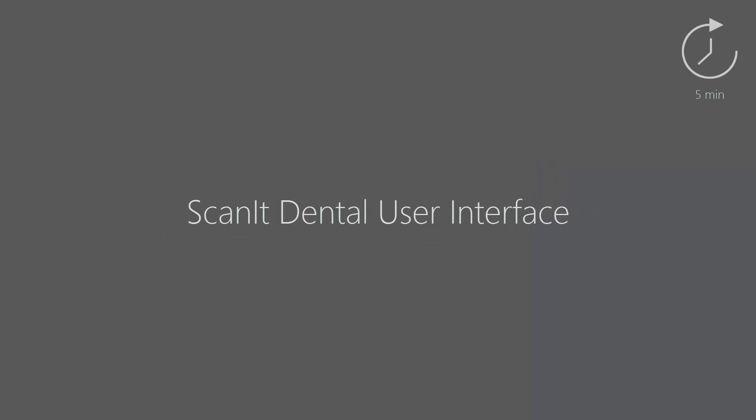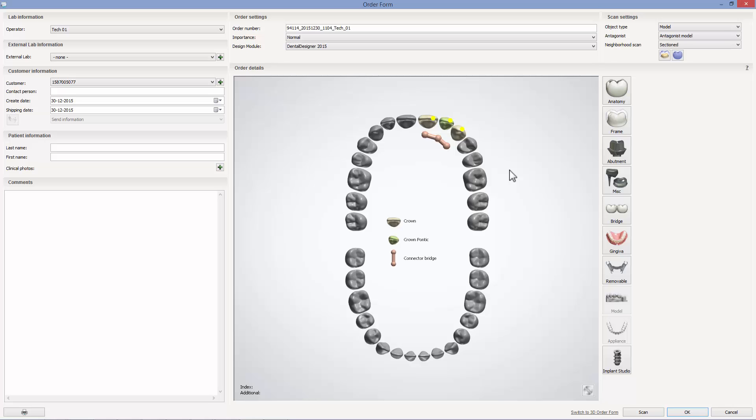In this video, we will introduce you to the ScanIt Dental user interface. This introduction will be based on the scanning process for a three-unit bridge.